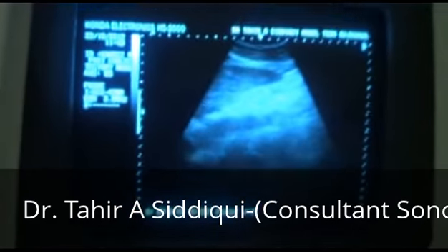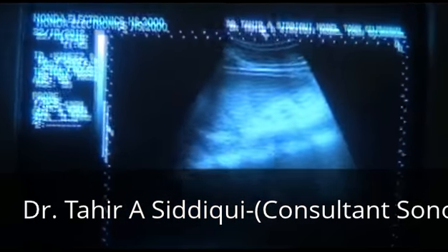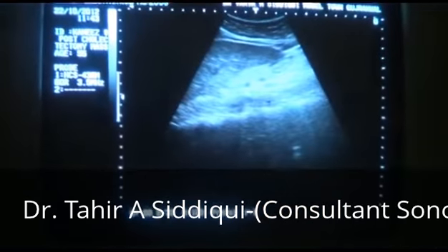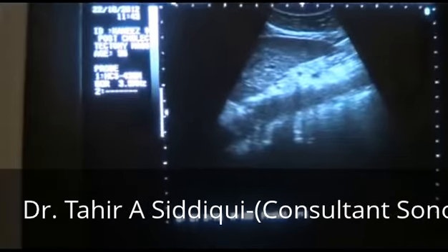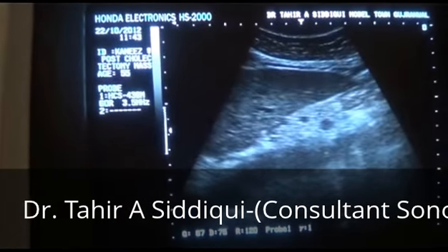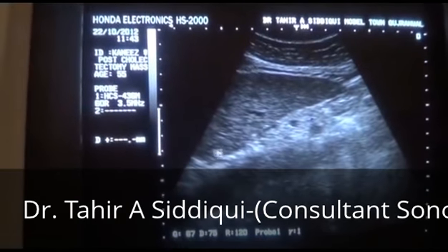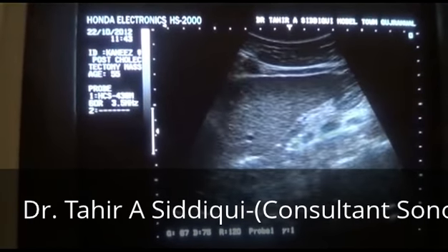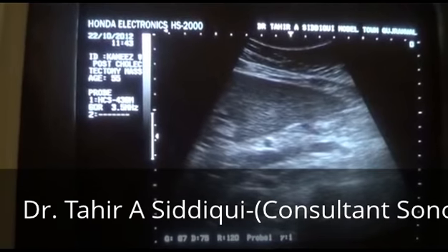I will go from the center, evaluate the liver first. This is the left lobe of the liver in longitudinal section. This is the aorta. This is the portal vein.